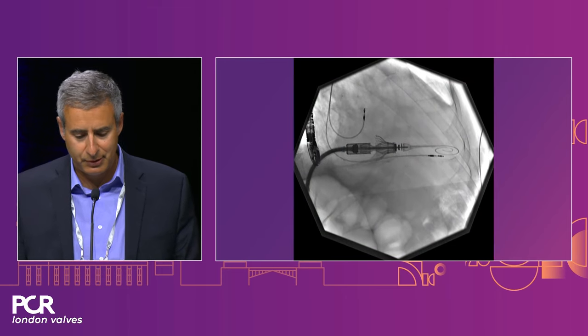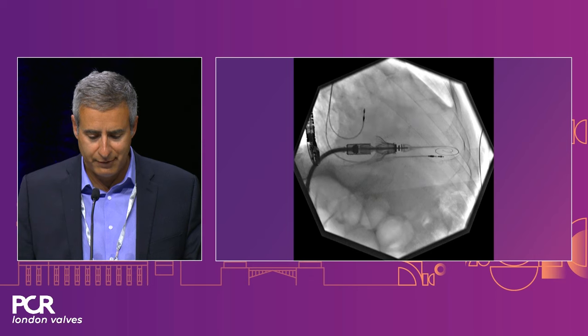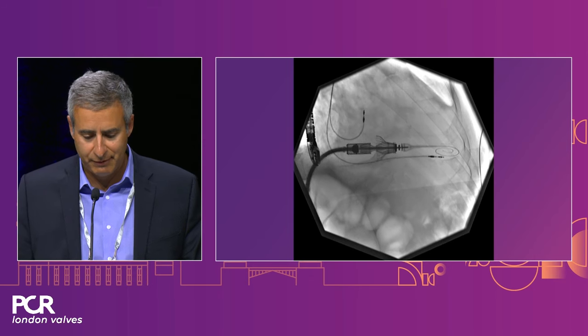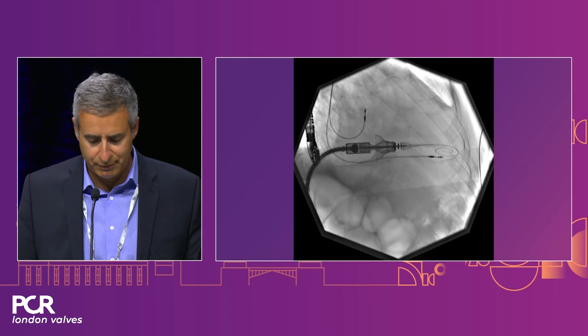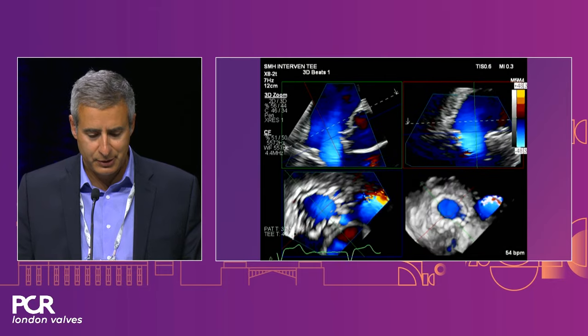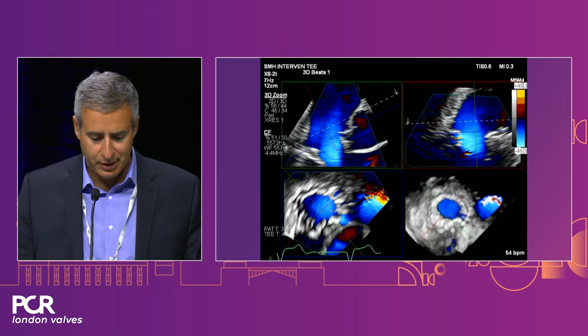Cardiovalve is very simple, a valve to implant. You only have to capture 2/3 of the valve leaflets for the device to be stable and also to abolish TR because an atrial flange is part of the fixation mechanism. So at the end of the procedure, there's no TR and the patient did very well.